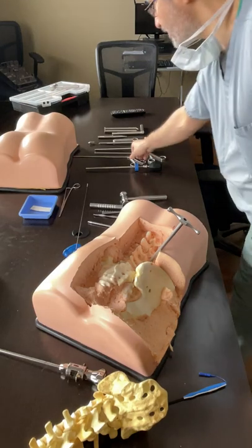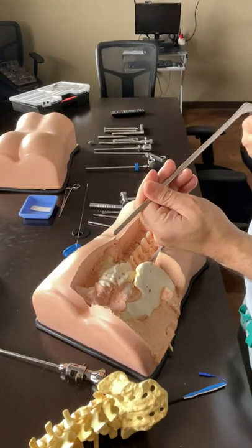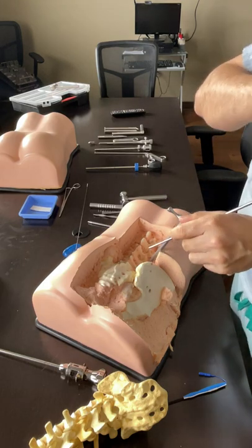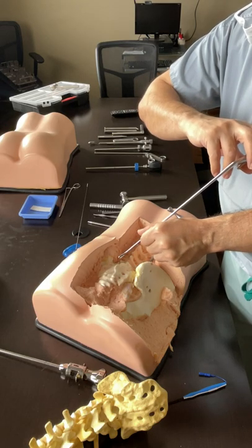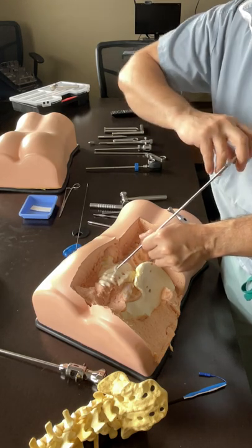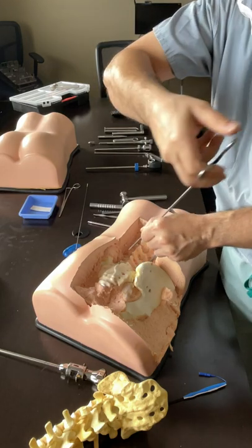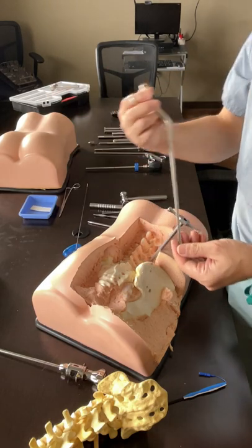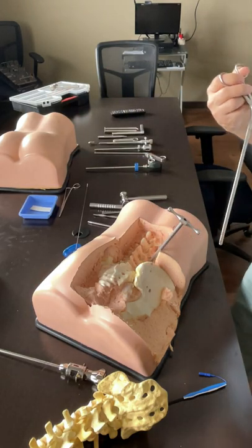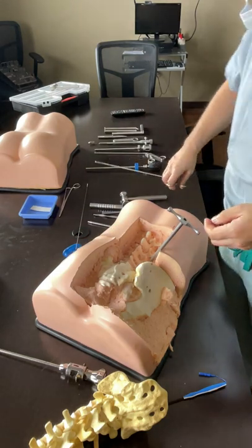Then I use the pituitary rongeur in this fashion: I go in and about to come out, I open it and take bites in all quadrants - I use it forehand, then I use it backhand, and take quadrants. Very useful tool. It just takes time to get used to it, but once you get used to it, you never do old-fashioned discectomy ever again.